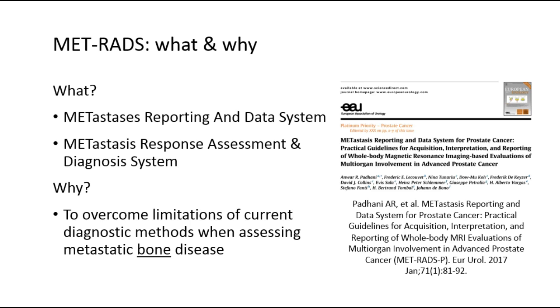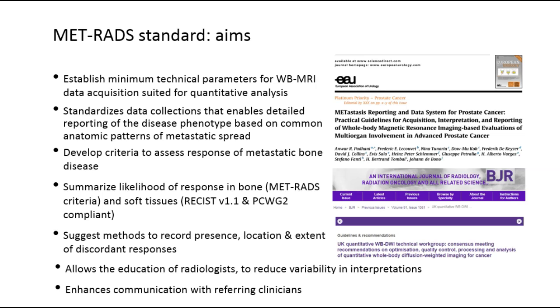So what is MET-RADS? In the official publication, MET-RADS is Metastasis Reporting and Data System. But sometimes I say it's Metastasis Response Assessment and Diagnosis System, and you'll see that this is truer to the actual contents. Why do we need it? To overcome the limitations of current diagnostic methods when assessing bone disease, in particular, as already discussed by Alberto.